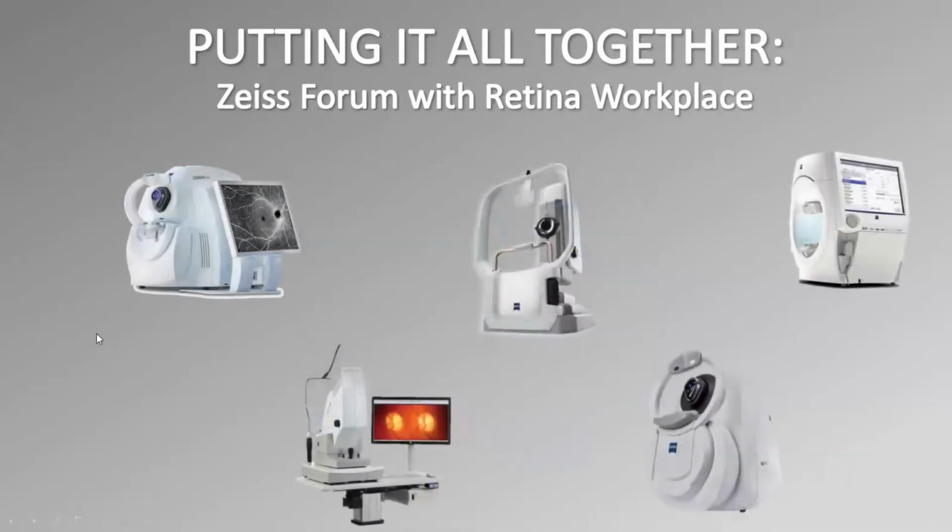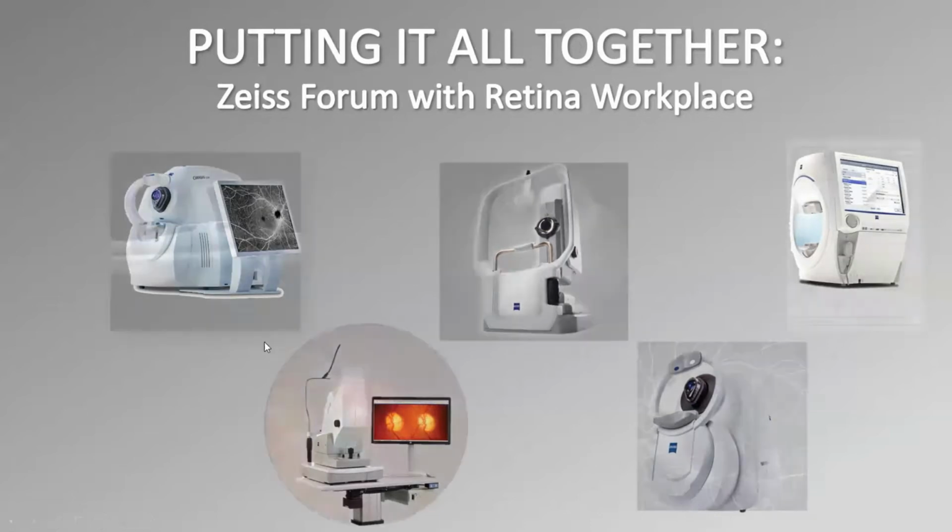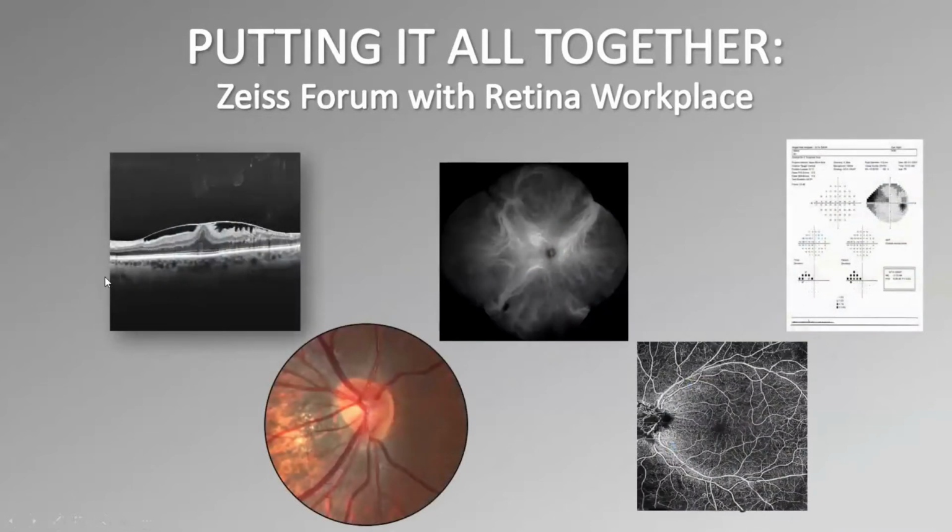This talk is part of a larger virtual user meeting that Zeiss has been gracious enough to put on over the past several weeks. And hopefully, as part of that experience, you've been able to learn a little bit more about some of the innovative and powerful imaging devices from Zeiss, including the Cirrus 6000 and the Clarus 500 and 700. Certainly, these devices provide a lot of opportunities to use this multimodal functionality to explore different aspects of retinal disease, which I think can really help boost the diagnostic utility of your retinal imaging.